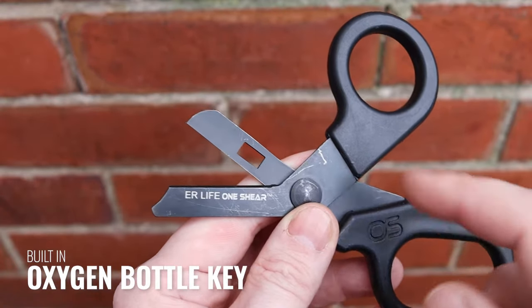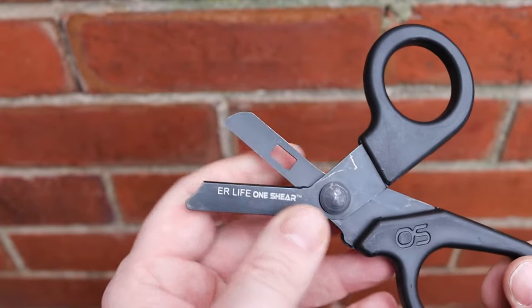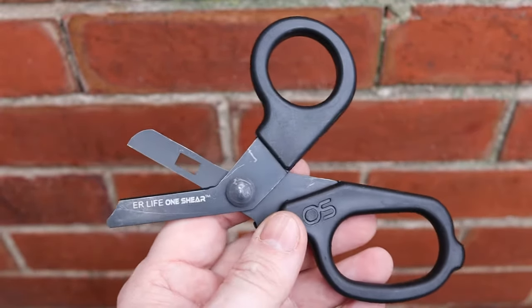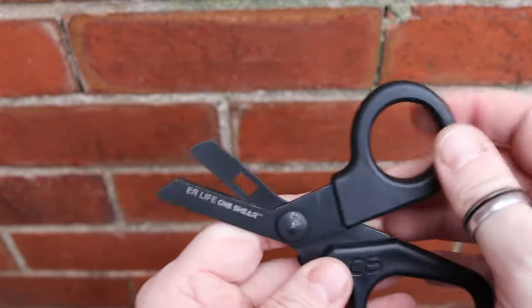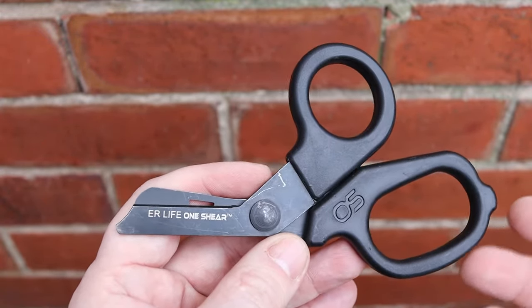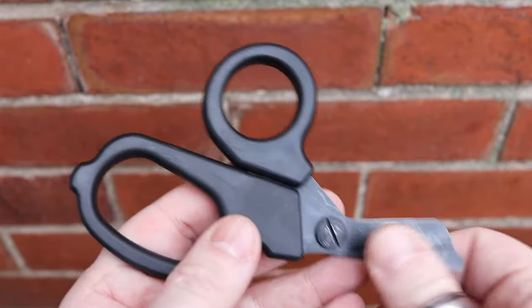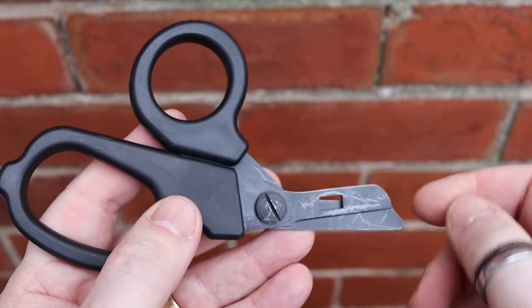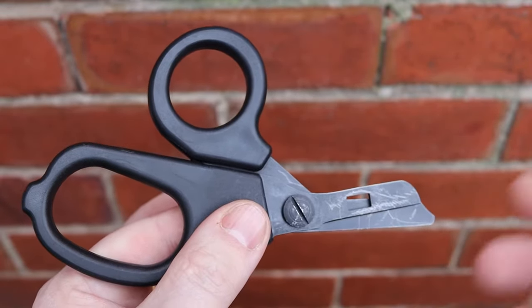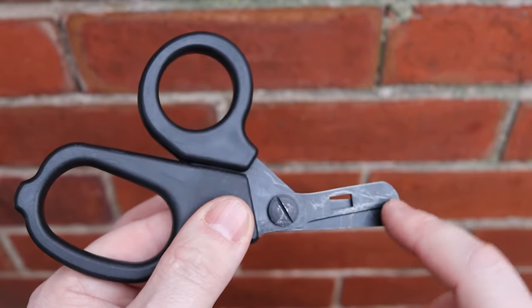There is also a valve key on here — if you need to open or close oxygen valves, that feature is there as well. Not particularly useful for EDC, but it's a nice feature. These are designed for trauma scissors but I'll flip this over — you can see I've been using these quite a bit. These get used more than the larger ones just because they're so simple to put in a bag.